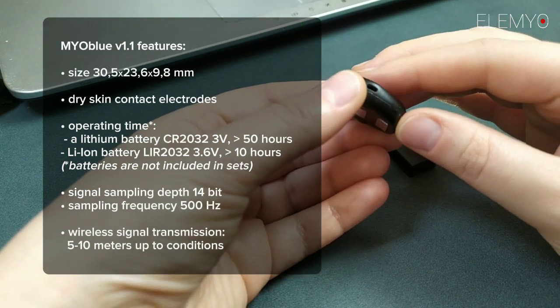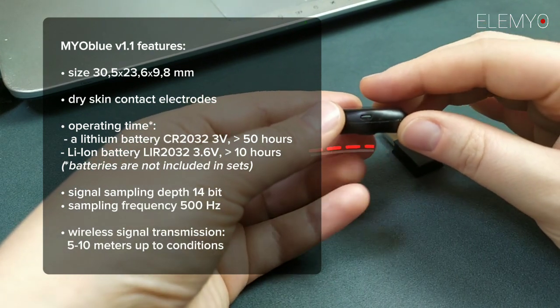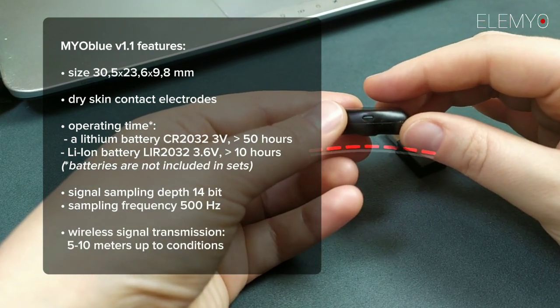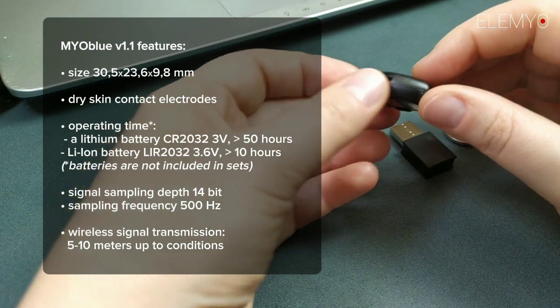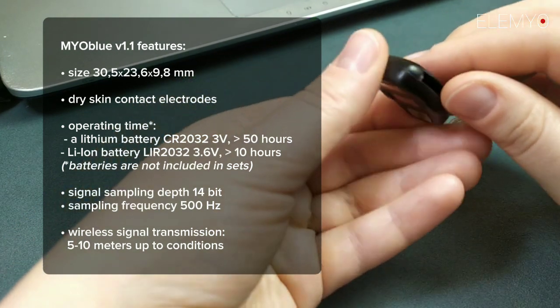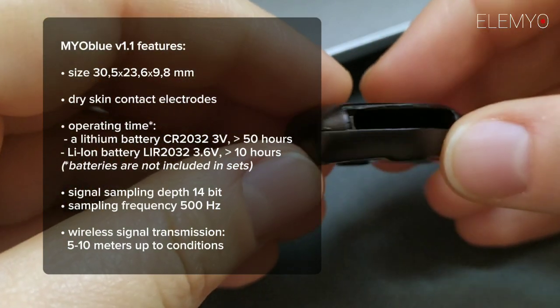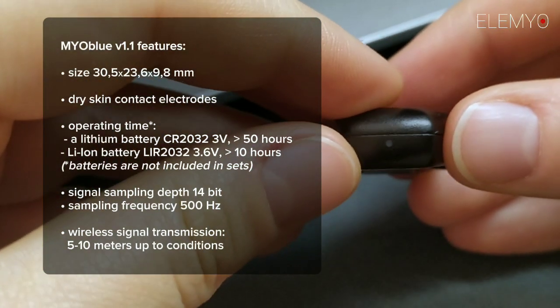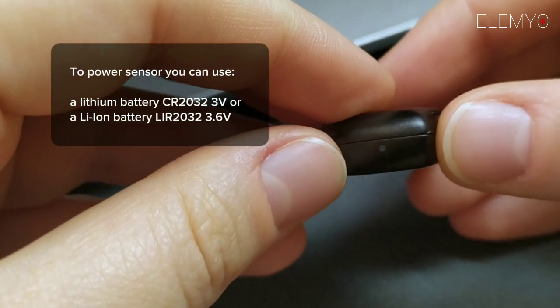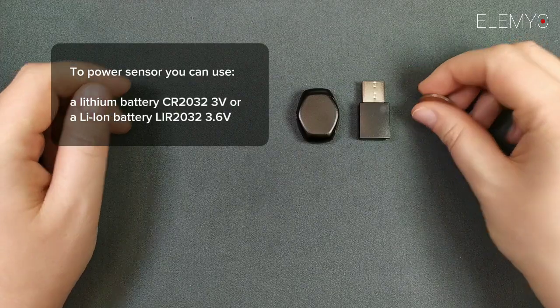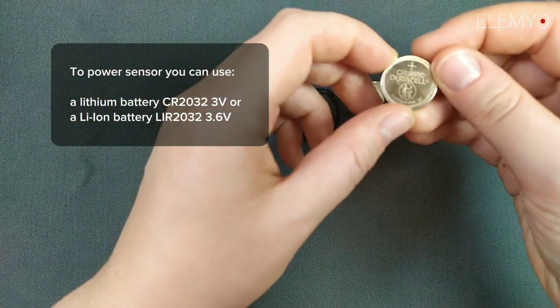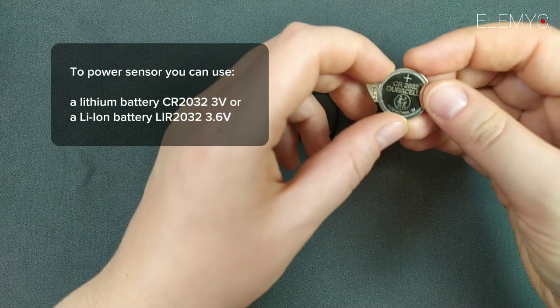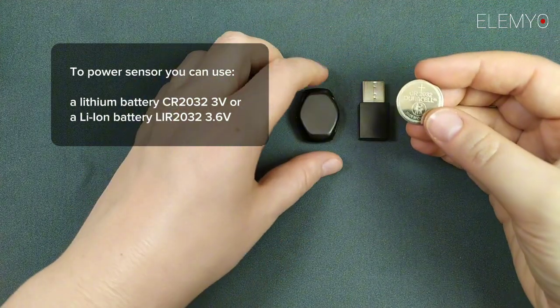The Myoblue sensor has curved contact surface for better skin contact. The sensor is powered by a standard coin battery and has an LED indication to check it. You can use a lithium battery CR2032 or lithium-ion rechargeable battery LiR2032 to power the sensor.